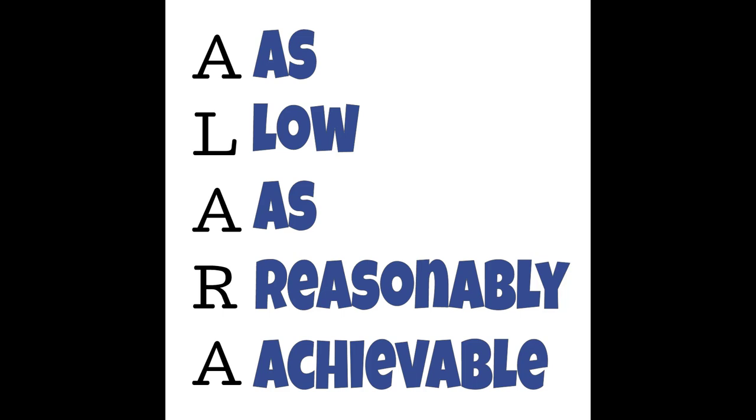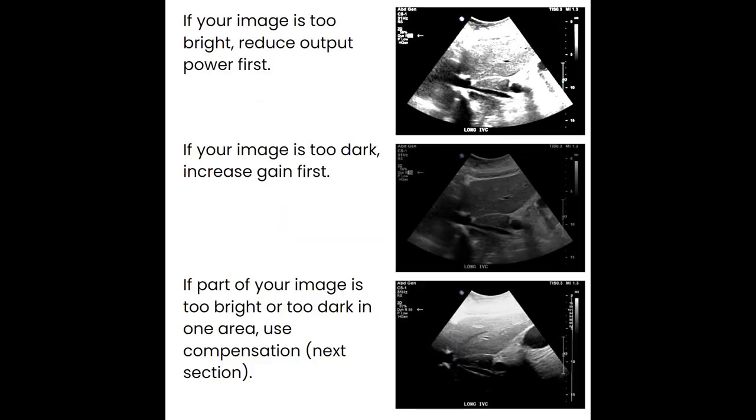So, for example, we're not going to use a very strong, powerful ultrasound beam on a first trimester ultrasound compared to the power that we would need to ultrasound an adult abdominal exam. The preset is going to be one of the more effective ways that you are going to make sure that you are not overexposing your patient to excessive ultrasound energy. So in theory, again, if our image is too bright, we need to reduce our output power first. If your image is too dark, then you need to increase your gain first.